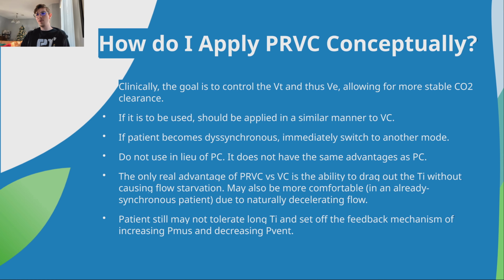The whole goal of this is the same goal as volume control. In the hospitals I have been to where they use PRVC, they use it the same way you use volume control. Okay? Clinically, it is a volume control mode.